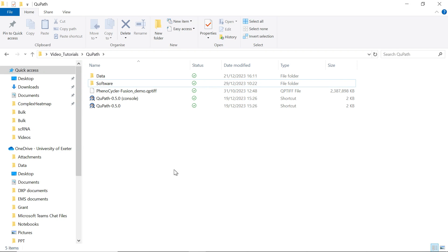Hello everyone. Welcome to my video tutorial for spatial dataset analysis. Today I'm going to show you how to use the QuPath software and perform cell segmentation analysis for spatial dataset.